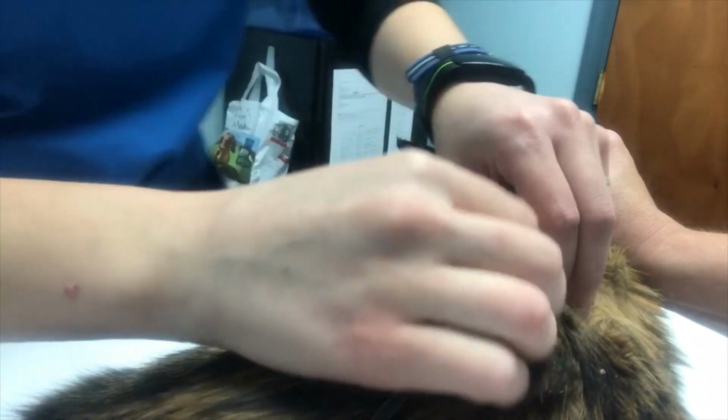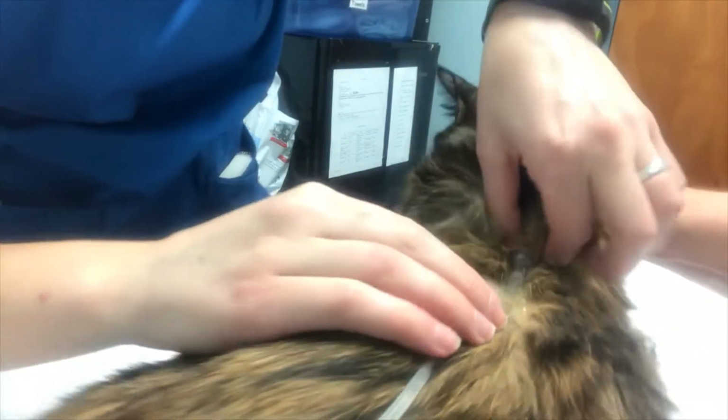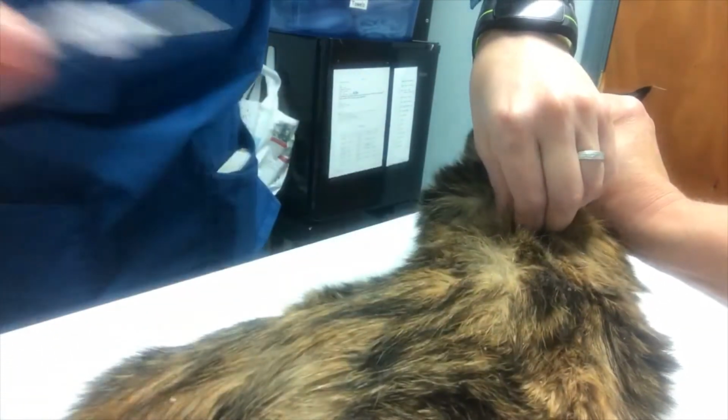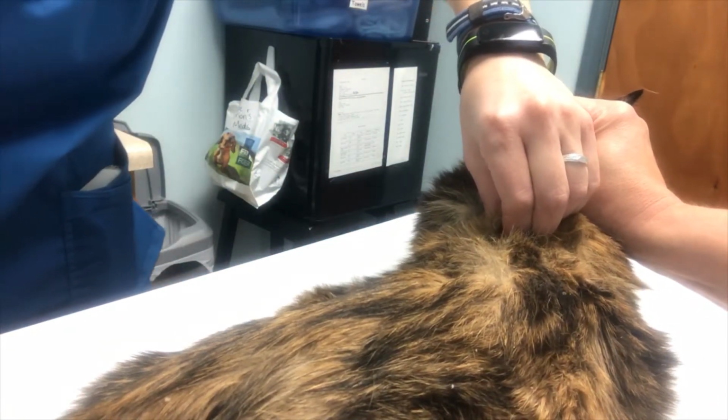So after clamping off the line, I'm going to gently pinch where the needle's at. That way when I pull the needle out, like so, it can help clot the skin so the fluids do not leak back out. And that is how you would administer sub-Q fluids.